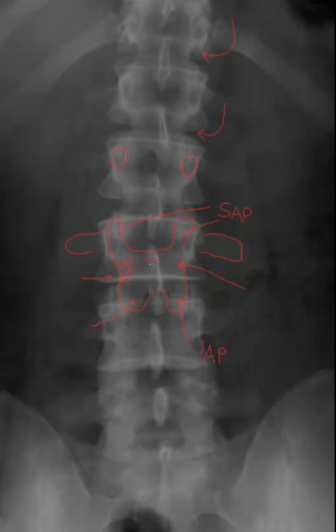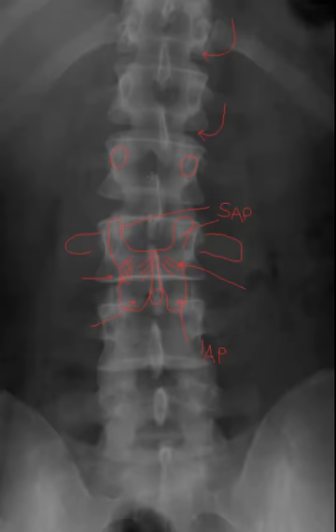Just next to the pars interarticularis is the lamina, and of course the spinous process. These structures can be seen well on the AP projection, but combined with the lateral we get clear visualization of all these structures.